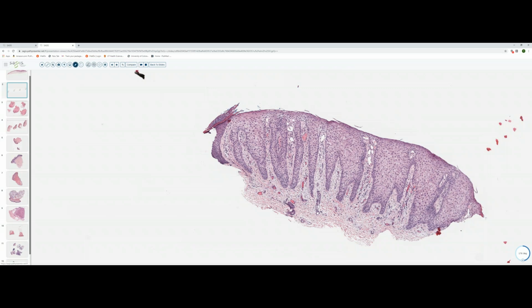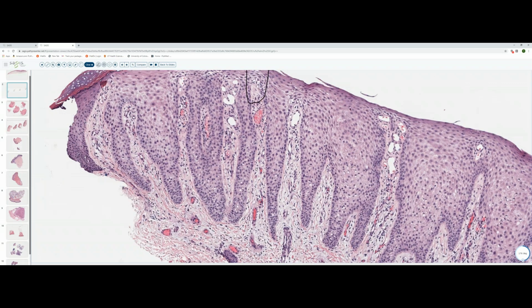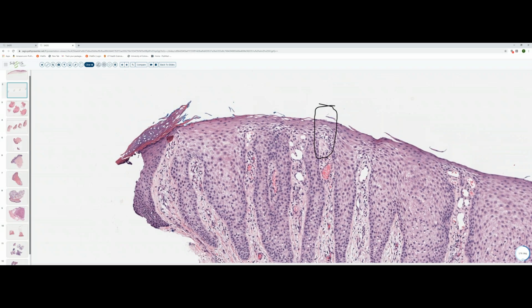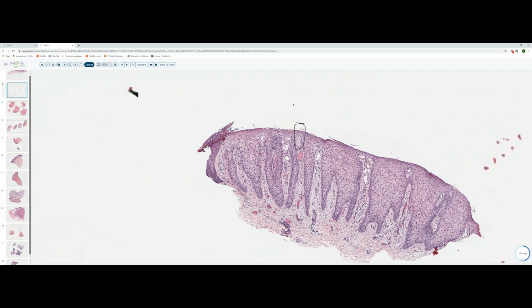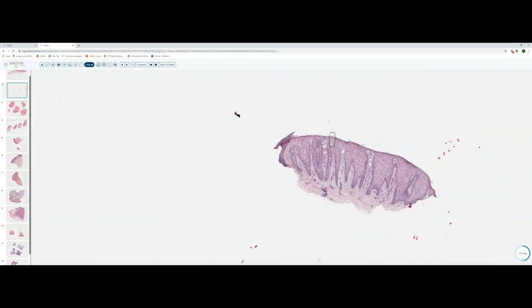As was the case in the biopsy of psoriasis we saw last week, there's thinning of the suprapapillary plates. There's really no discernible granular layer in most areas. There are dilated and tortuous vessels in the papillary dermis, and in a few foci there were even some neutrophils present between widened intercellular spaces. It looks a lot like psoriasis, and that's a feature that's very common in this condition.